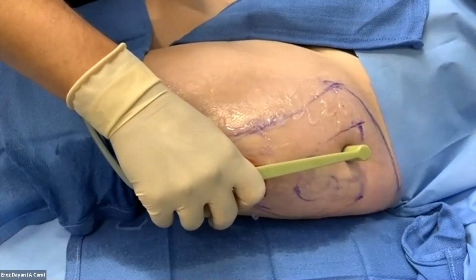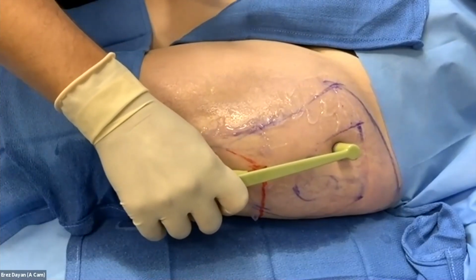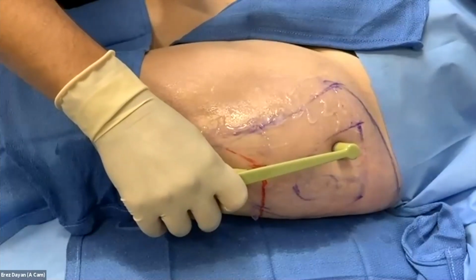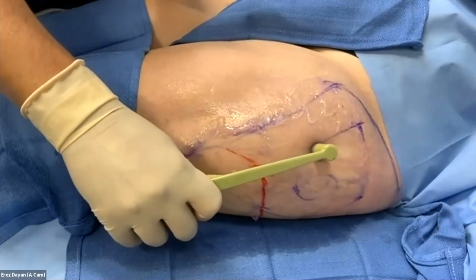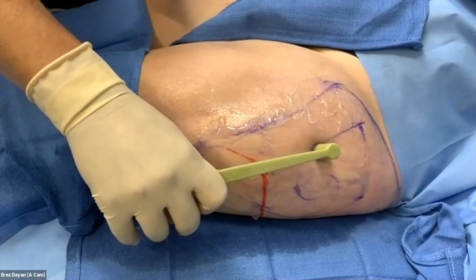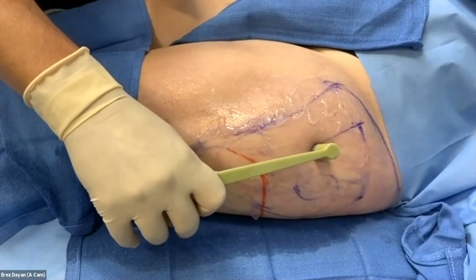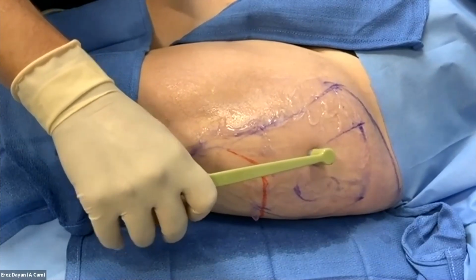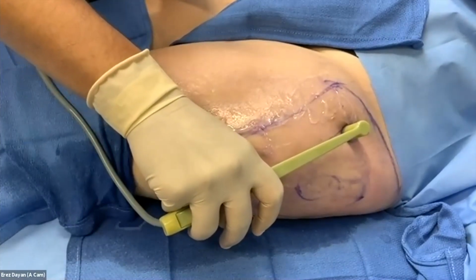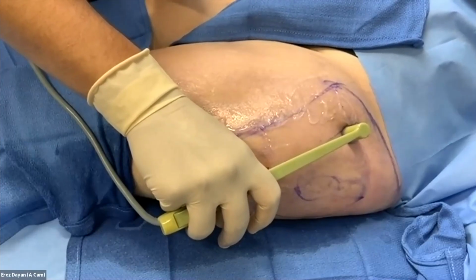Morpheus too helps with cellulite in my experience. So there's not many good options for cellulite. I think Cellfina doesn't really work great. I've seen a lot of bad complications from it. What complications have you seen from Cellfina? Oh, I've seen bad hematomas, really bad. That's actually caused major contour deformities. I can show you some pictures. I think the disposable cost is pretty high too, just from a practice standpoint. Do you use it a lot? No, I've never used it. It's basically subcision. It's basically a blade that just goes under the skin and cuts the fibers.